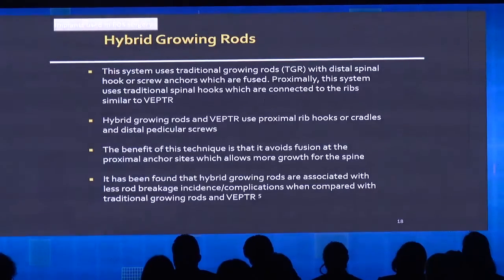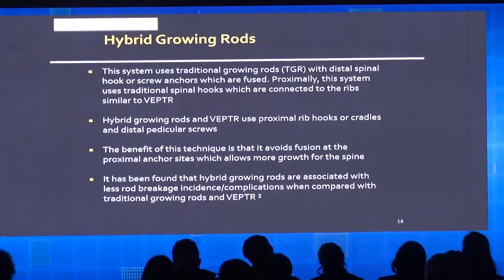In case of hybrid growing rods, just like we have seen one, they are providing better results and less complications than the classical growing rods.